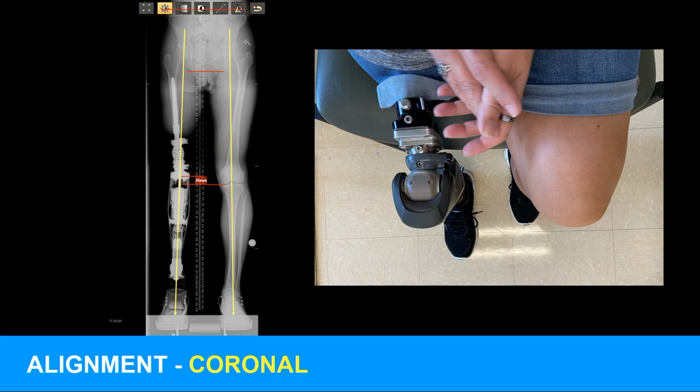Coronal alignment is so easy with above knee as long as you predict the adduction and simply adduct that limb until the pylon is vertical in mid-stance, and when you take an x-ray, your femur is in normal adduction.